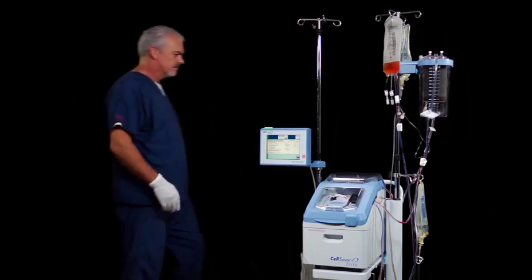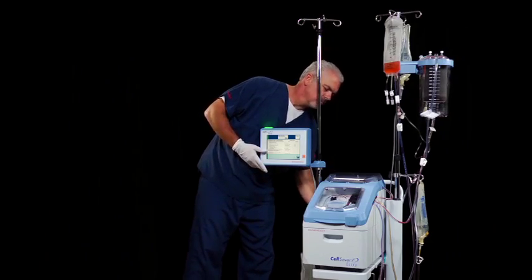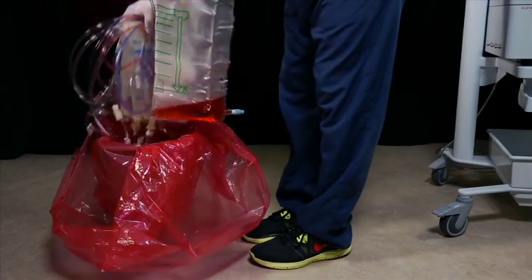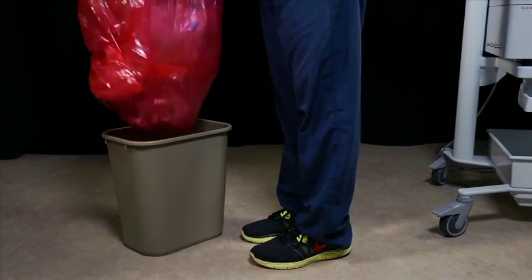Once the user has performed all of the desired manipulations, the device should be powered down and all disposables should be discarded according to facility procedures.